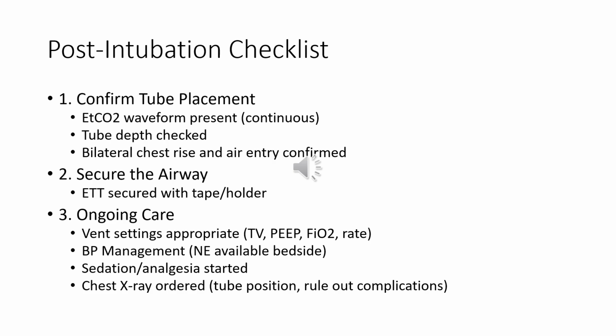Every step in the intubation checklist is vital for patient safety and procedural success. Following this systematic approach helps prevent errors, anticipate complications, and ensure the best possible outcomes for patients.